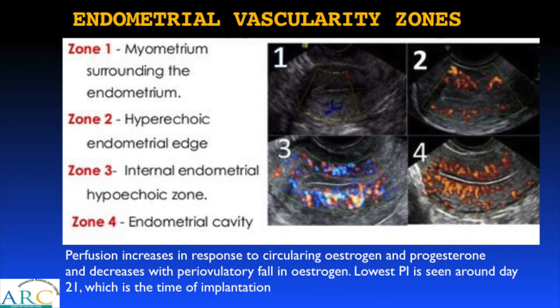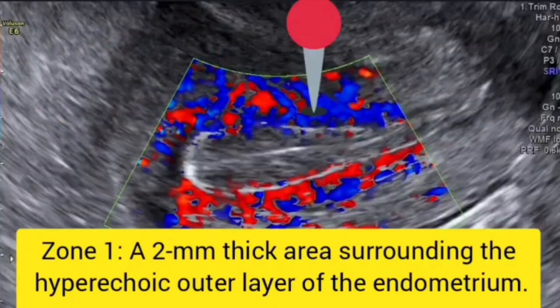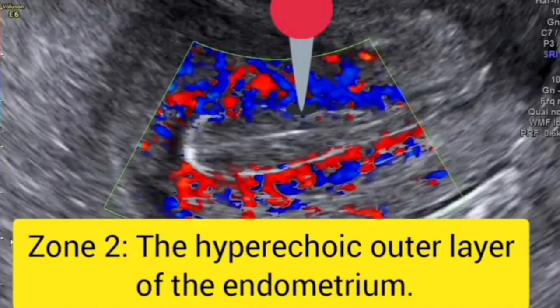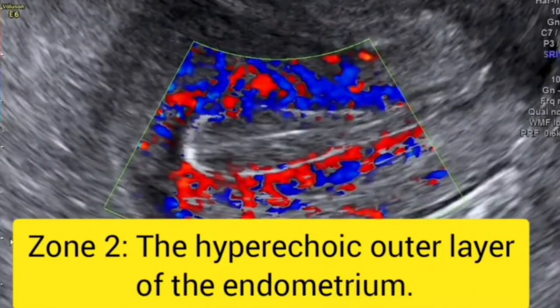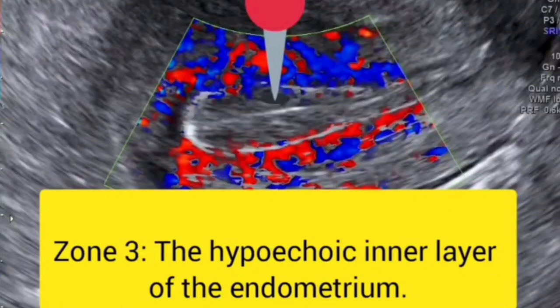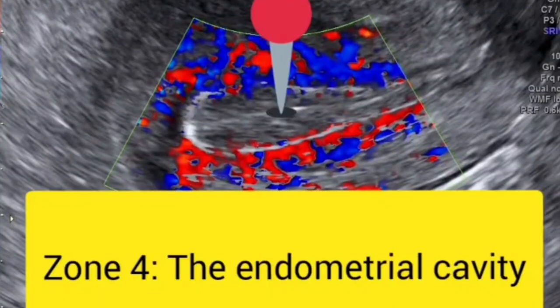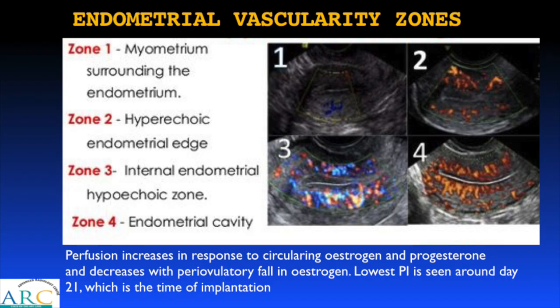Endometrial vascularity zones are described according to vessels seen in different layers. Zone 1 is vascularity in the myometrium surrounding the endometrium; Zone 2 is vascularity in the hyperechoic endometrial edge; Zone 3 is vascularity in the internal hypoechoic zone; and Zone 4 is vascularity within the endometrial cavity. Perfusion increases in response to circulating estrogen and progesterone and decreases with the periovulatory fall in estrogen.